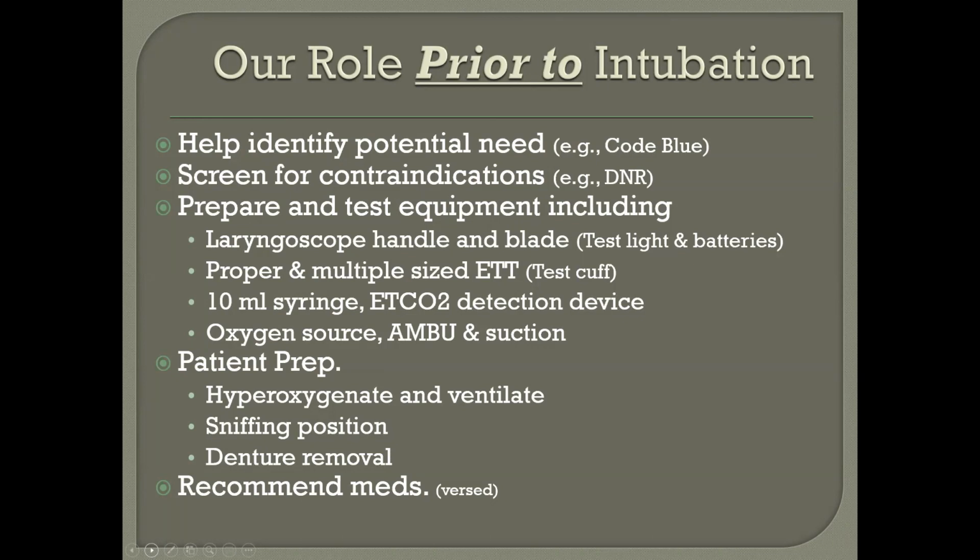So if you're putting air in an LMA, you're deflating, you lube it up real good, you put it in place, it's going to take probably 30, 35 mLs of air in it versus 7 to 10 for an average ET tube, 5 to 10, 5 to 8, something along those lines. Just a little sidebar tidbit there.